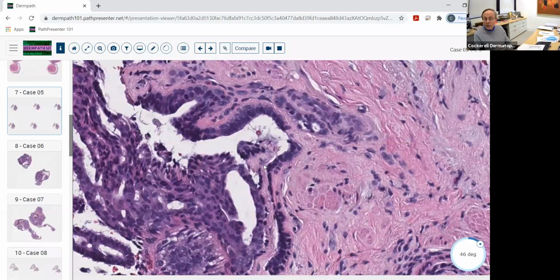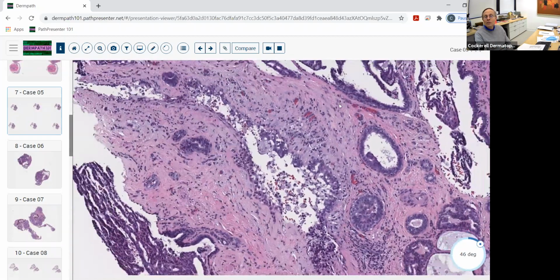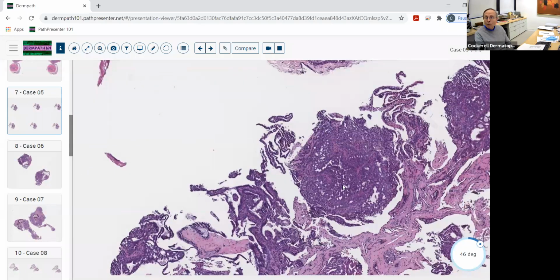So obviously, if you see apocrine embryology, you're going to see tumors that can develop in adults or in kids that give apocrine differentiation in that area. So anytime you have that lineage, you can get these lesions, benign adnexal neoplasms with apocrine differentiation. So this is a nipple adenoma. And notice that it looks very much like what we would call a papillated apocrine cystadenoma if it was anywhere else.